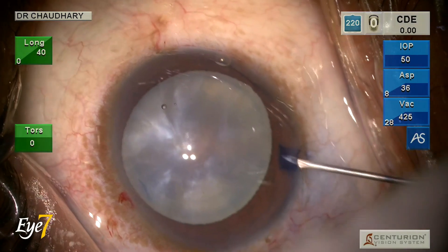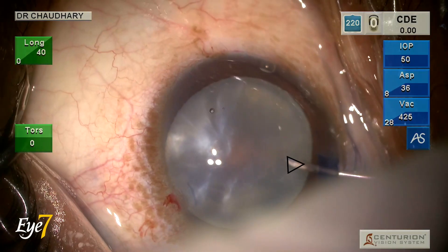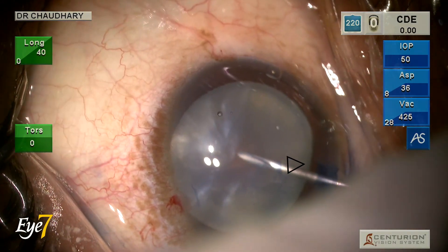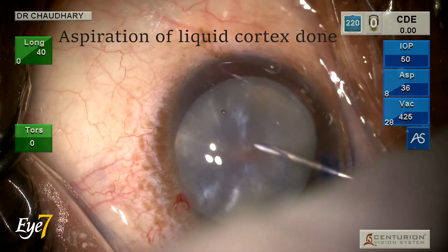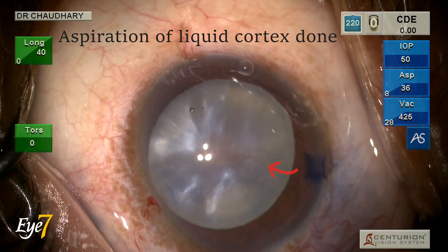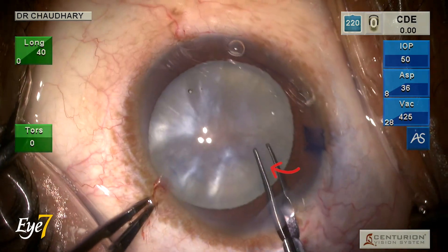Keeping the anterior chamber filled with viscoelastic, a 27-gauge straight needle is used to give a 0.5 mm base-in nick on the anterior capsule. Aspiration of liquid cortex is done using this 27-gauge needle attached to a Dispo band syringe.